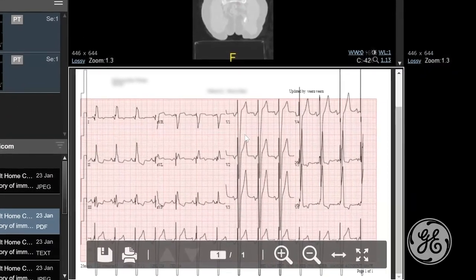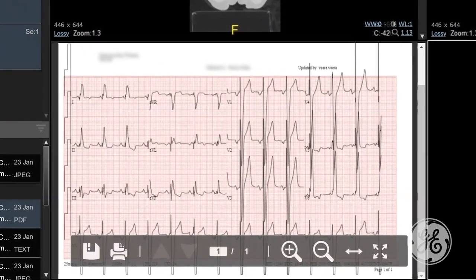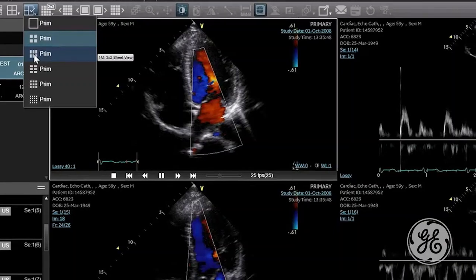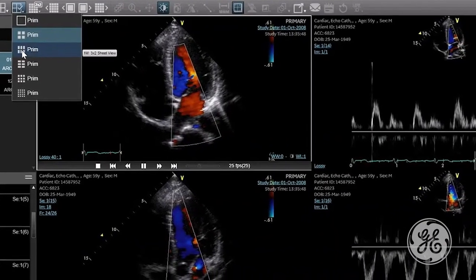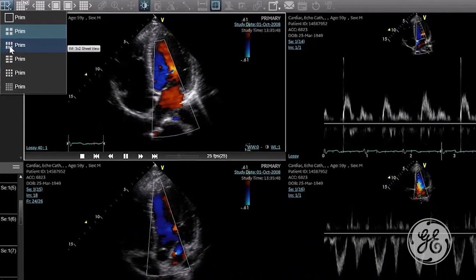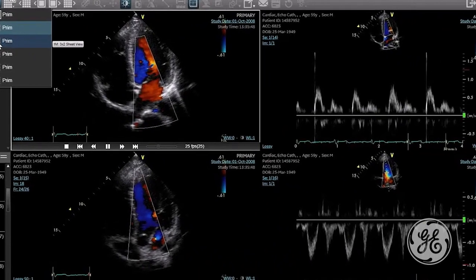They may even include graphs such as EEGs or EKGs. If it is digital and stored in the Enterprise Imaging Archive, it can be displayed by the zero-footprint viewer from GE Healthcare, regardless of the PACS or the image storage system.